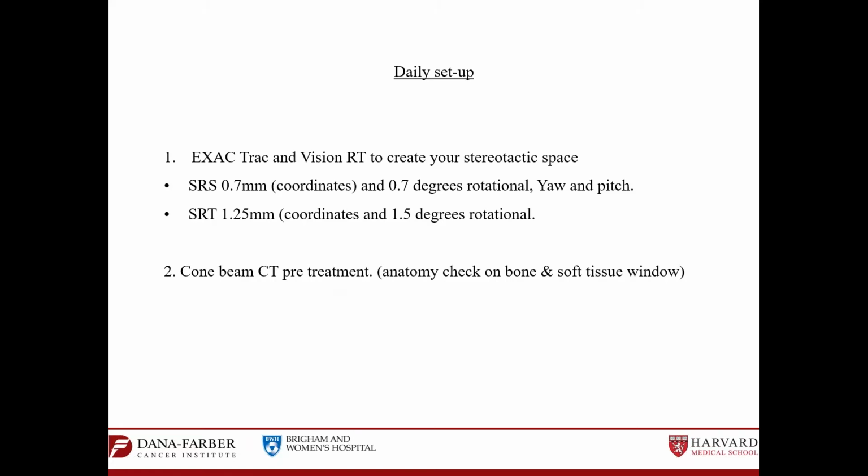Don't worry about the skull and the bone. The bone is like the outline and should not be tilted for sure, but you have to be more careful about the soft tissue component inside the area you're treating. If you're treating many lesions, then you have to be careful that you have a global fusion, a global cone beam CT that is accepted to treat your patient. So it's an anatomical check.